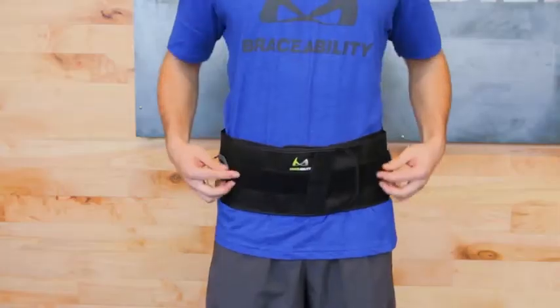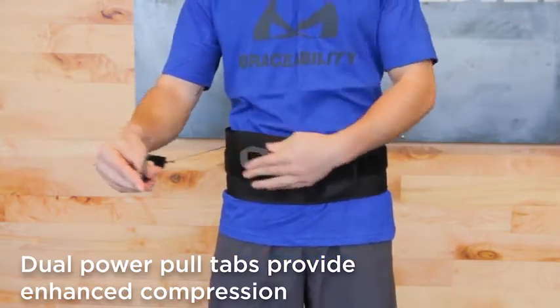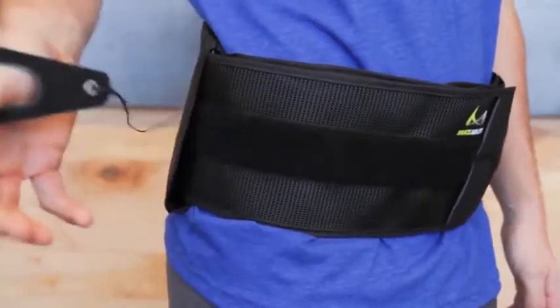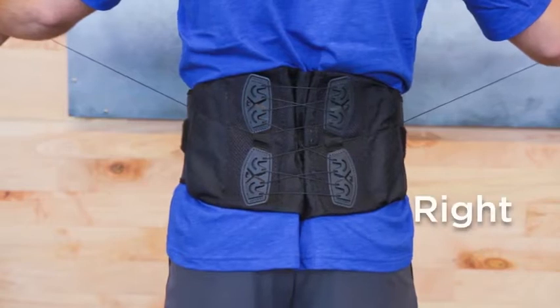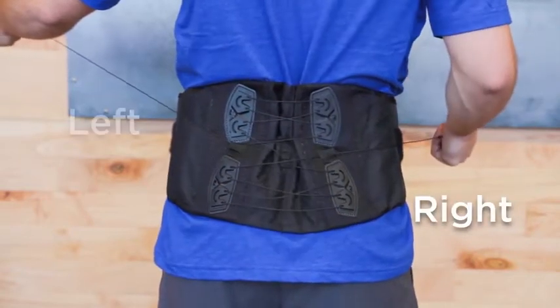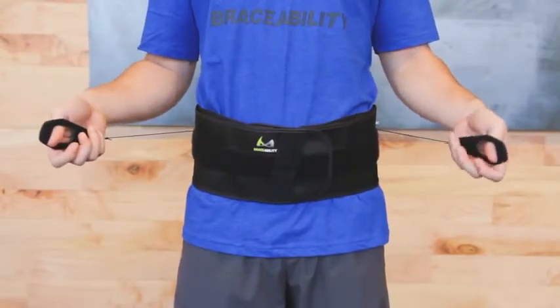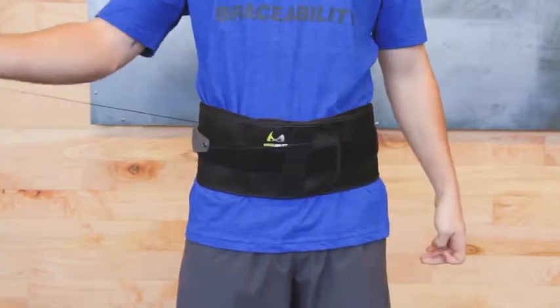Once the brace is on, dual power pull tabs deliver controlled compression with minimal effort. Simply slide your thumbs through the pull tab holes and pull them away from your body. Your right pull tab controls lower compression and your left pull tab controls upper compression. Apply tension until desired support is achieved, then wrap the pull tabs around to the front of the brace.